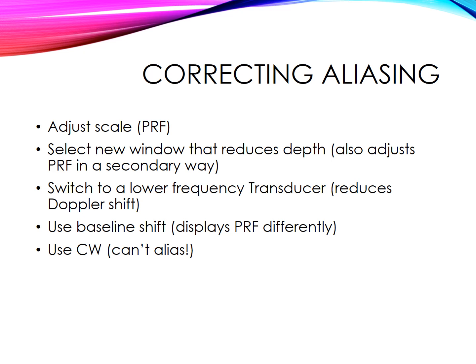As you take your boards, you're going to have these questions on there with a console with all of this information, all these dials and stuff that you can change, and it's going to give you a picture of a blood vessel or something that's going on with aliasing, and it's going to say, hey, what can you do with this? You need to be able to look at all the settings that fake console is set at and see what you can change to help get rid of all of that aliasing.